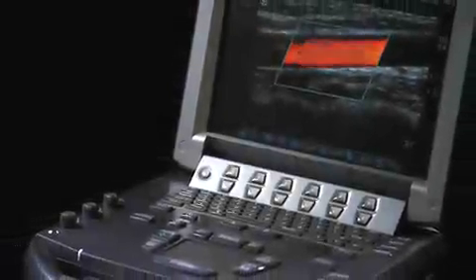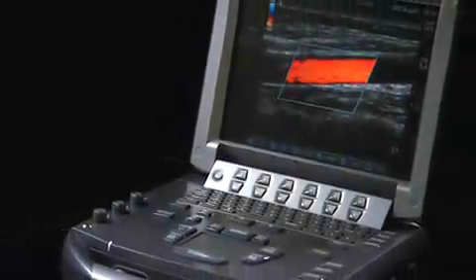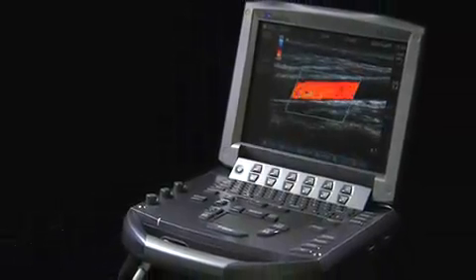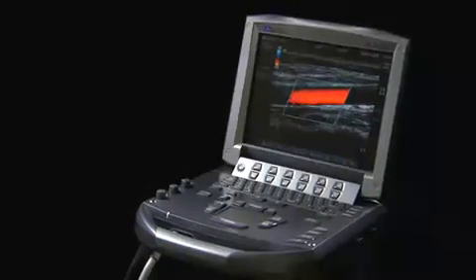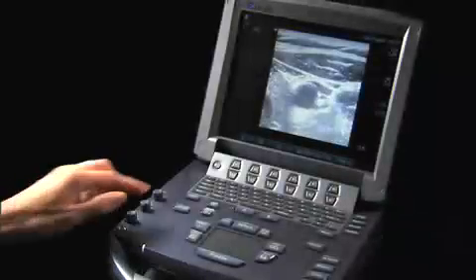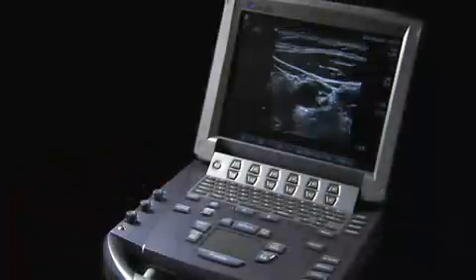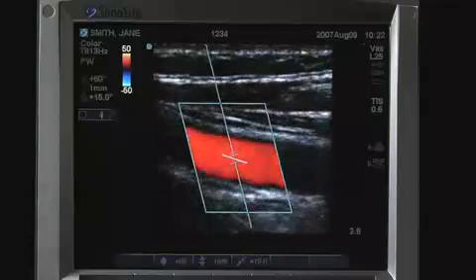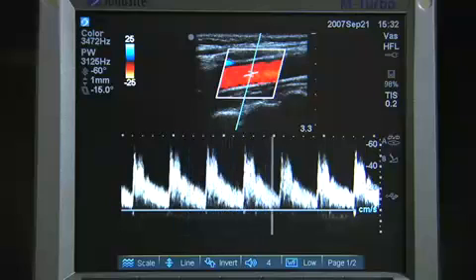The Sonosight M-Turbo offers superb image quality, increased speed, and Sonosight's traditional reliability in a laptop-sized unit. This short video will demonstrate the key features and functions of the Sonosight M-Turbo system. For more in-depth information, please refer to the system user guide.